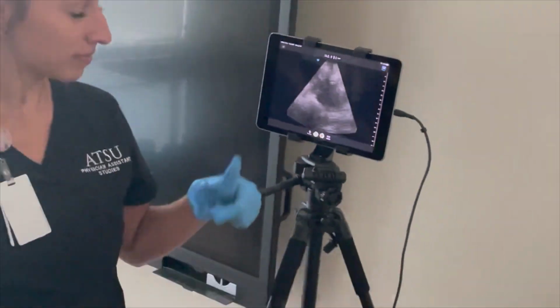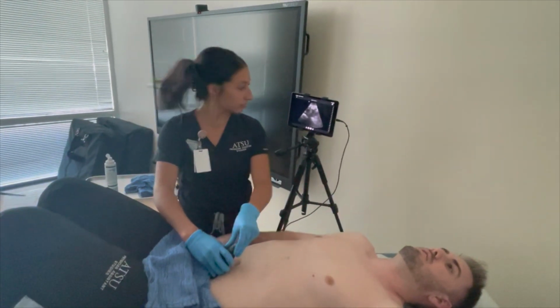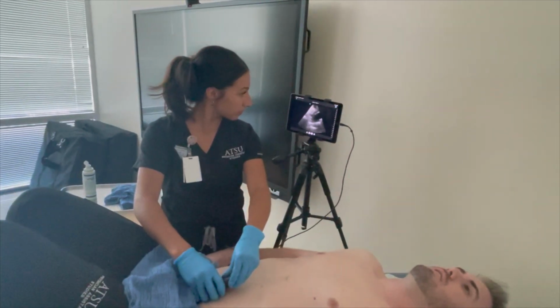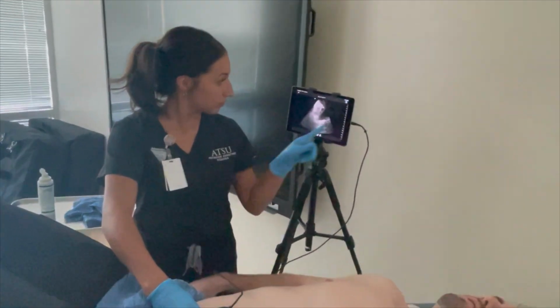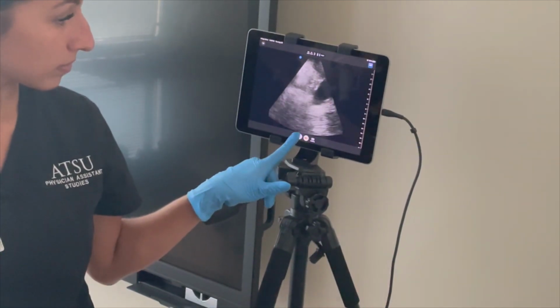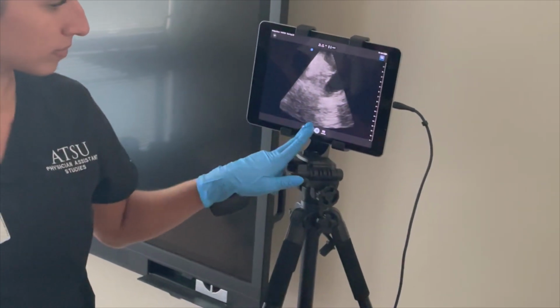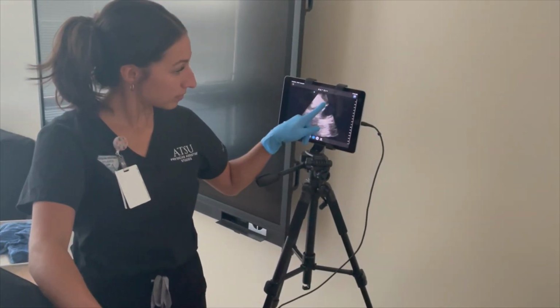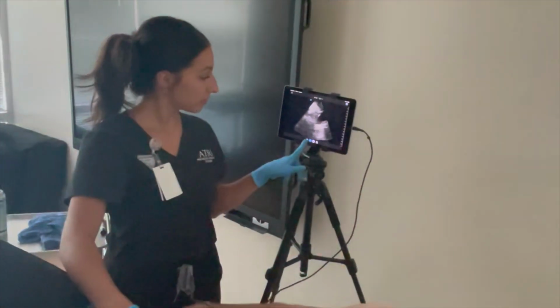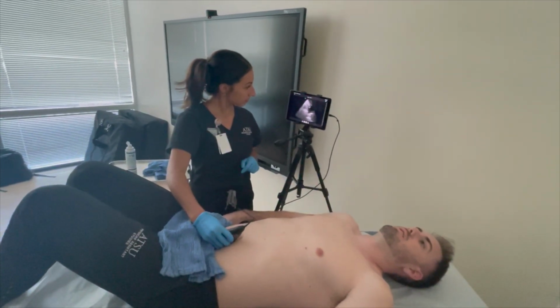Then you're going to rotate the transducer 90 degrees with the indicator pointing towards the patient's head to get a longitudinal view right above the pubic symphysis and point the probe downwards towards the pelvic cavity. You're going to observe the lateral borders of the bladder to identify free fluid by tilting and fanning the probe left and right. Free fluid will accumulate in the rectovesical pouch in a male pelvis and in the pouch of Douglas in a female pelvis. A tip for this is to scan the patient with a full bladder to help visualize the structure.